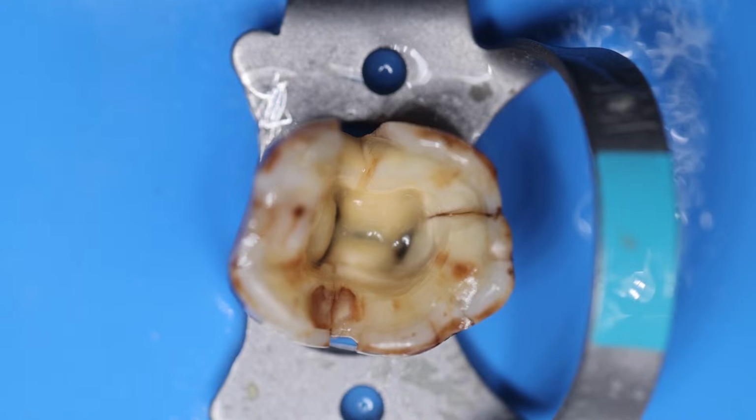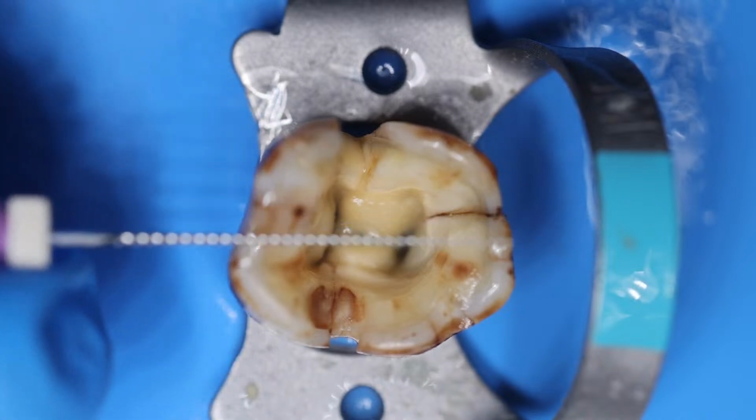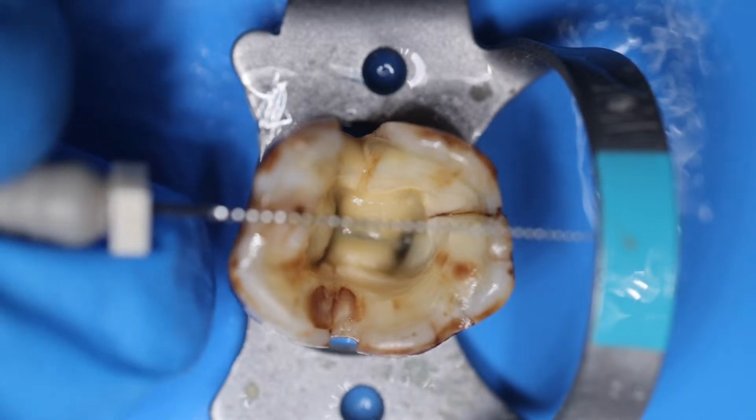So once done, since you are assured that these are the canal orifices, you can proceed with one more thing, and that is to use a 10K or 8K file. Over here we are using a 10K file. You can also use an 8K file. This is just for initial canal negotiation. You have to negotiate that these are the canals only.